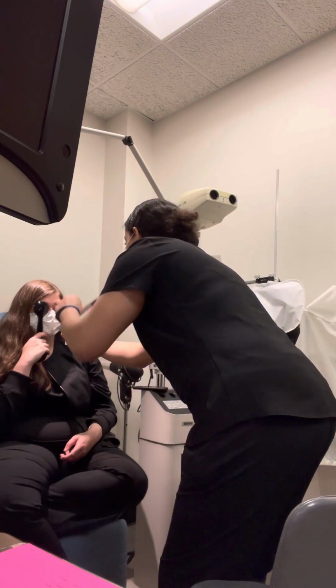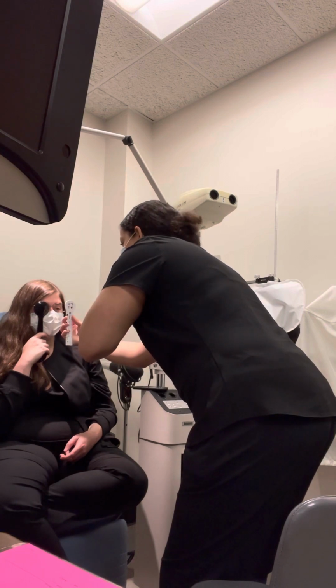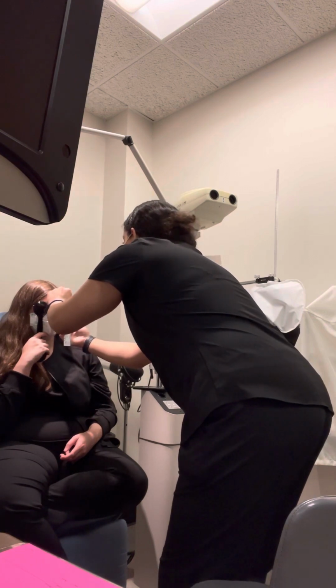No. Okay, go ahead and close it. Blink a few times for me. Does it clear up at all? No. Okay, go ahead and close your eyes. Measure your pupil size in the dark.